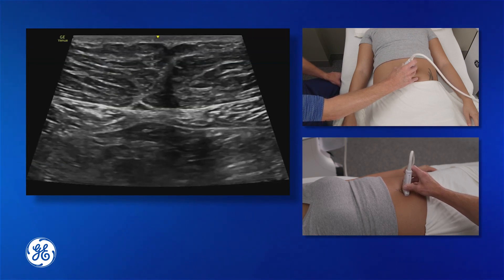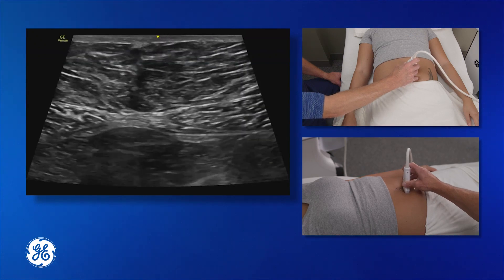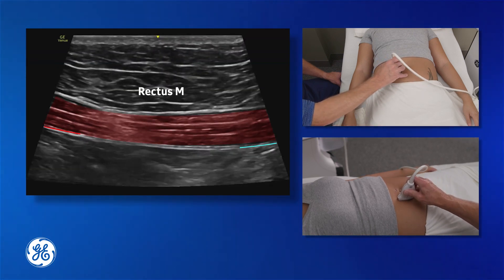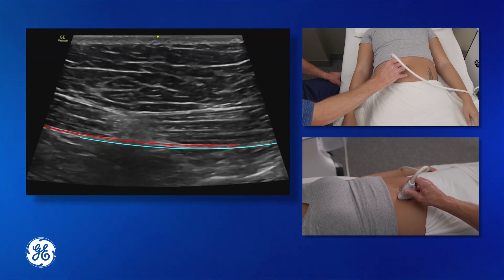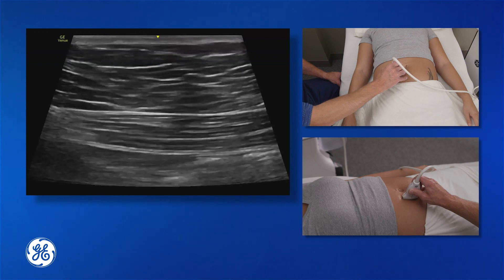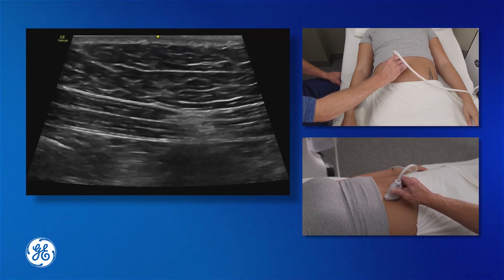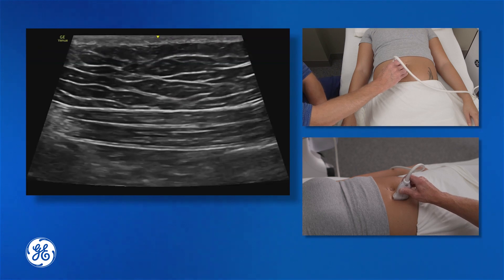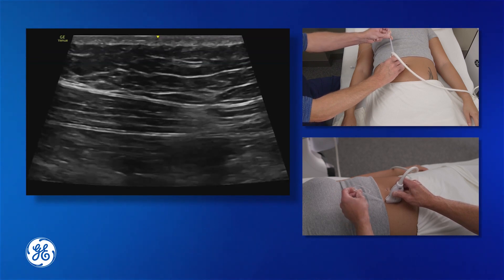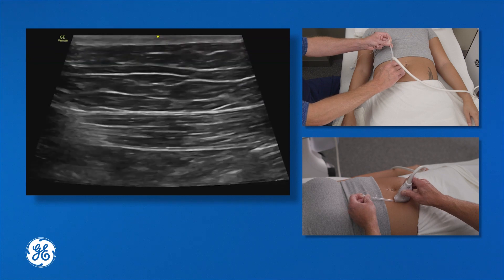Again, reviewing the anatomy: we have the rectus muscles on either side with the linea alba in the centre and that double line of fascia. Moving the probe into the paramedian view, we can again see the rectus muscle and the double fascial plane, as well as peristalsis of the bowel below. One benefit of the paramedian view is we can move the probe distal and proximal — caudad and cephalad — following those rectus muscles up and down. We insert the needle from the cephalad or caudad end of the probe, bring it through the rectus muscle, inject above the posterior fascia, and continue inserting the needle to follow the injectate down.